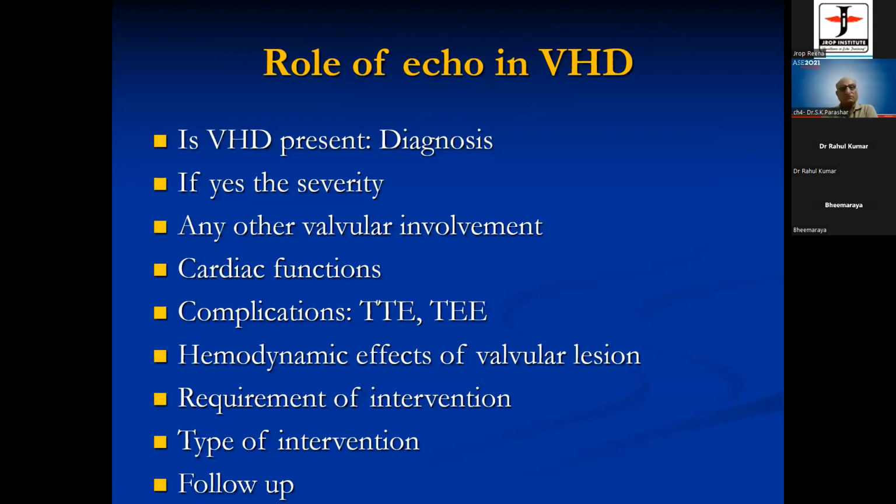So now the role of echo in valvular heart disease: number one, is valvular heart disease present? In other words, a diagnosis. If it is present, then what is the severity? Then is there any other valvular involvement? We always say that always examine all the valves rather than sticking to one. Cardiac functions are important, which you will see over a period of time. Then what are the complications?